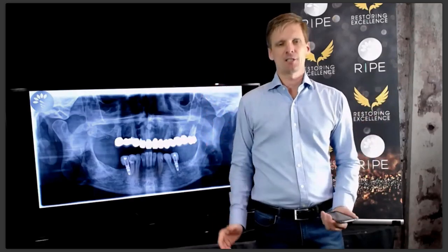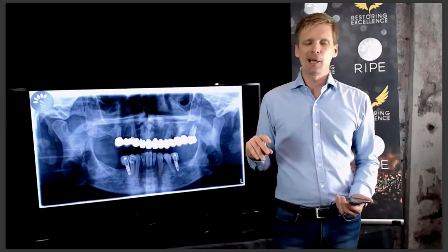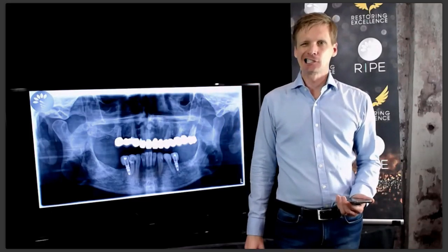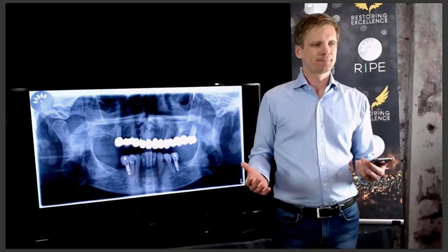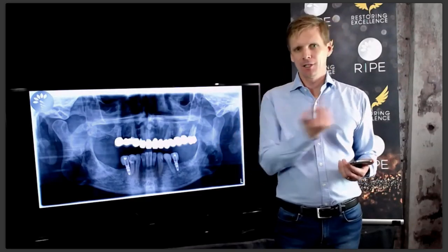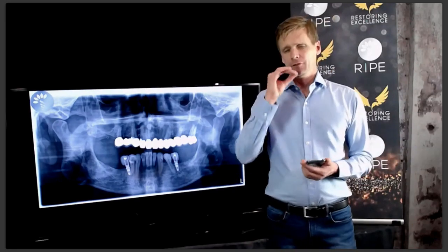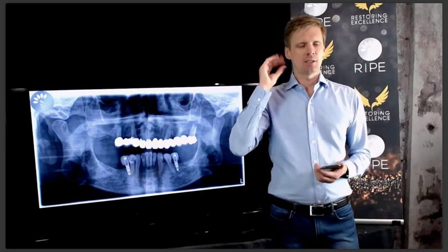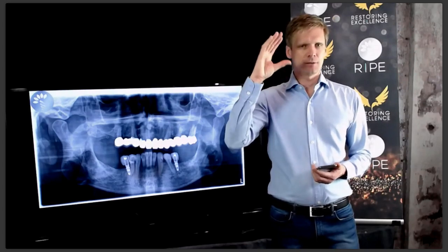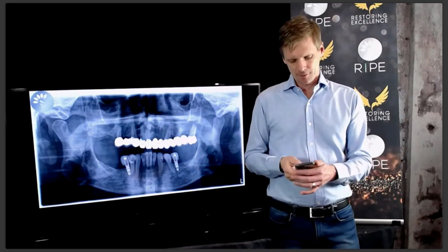And the reason why I do it like this is because it keeps everything perfectly balanced as you drop them down. If you just get the patient to go chomp, chomp, chomp, okay, the patient might be posturing off to one side like this, and then you adjust everything, and then they start moving over to the center, and then you've got to adjust everything on the other side, and it takes forever. So leaf gauge, jack them up till one tooth is touching, adjust that one spot, take out a leaf, drop them down bit by bit, and then once you finish dropping them down, they're perfectly even.